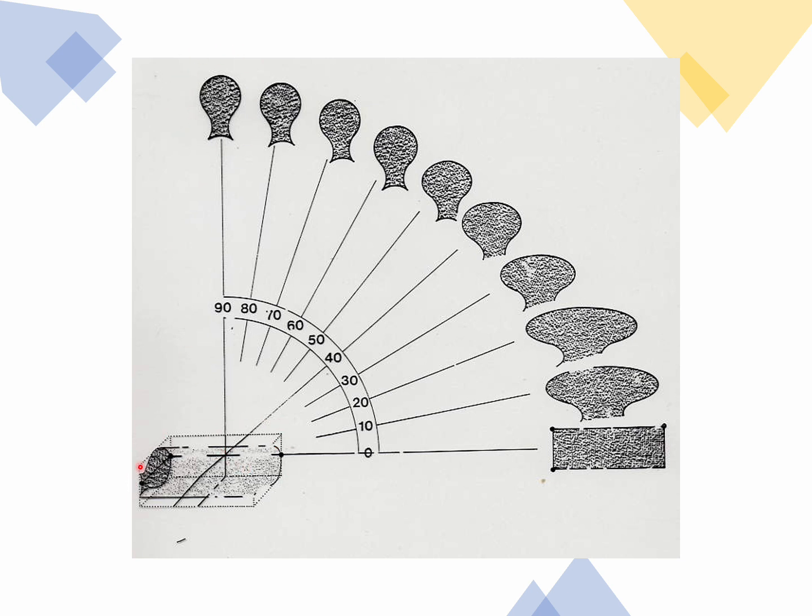Imagine that you have a cucumber and you are cutting it with a knife. Each time you deviate the knife to an angle, you're gonna have a wider circle. That's actually what happens here. The more obtuse the angle is, the more the circular and widened shape of the keyhole is gonna be seen.